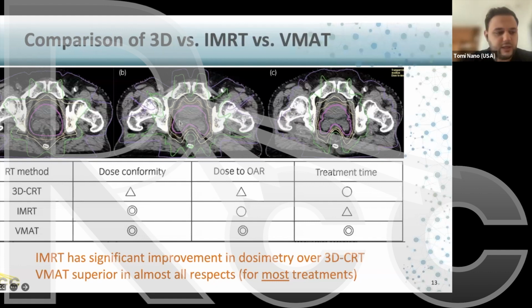Maybe we can take a break here and see if there are any questions that I can answer at this point, or should we continue? In static IMRT, are these control points the same ones that can be used for plan QA?